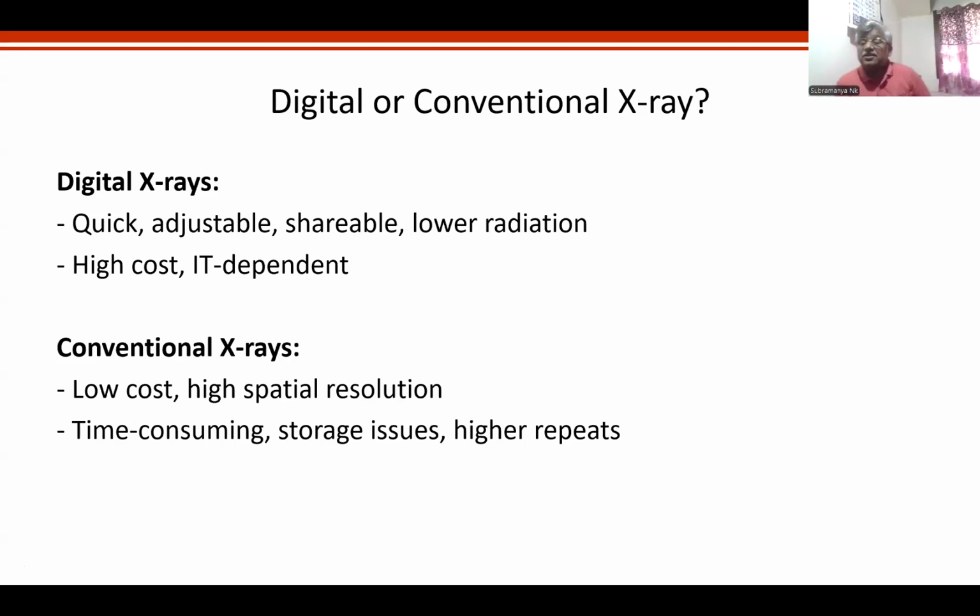And when you take a digital X-ray, ask for them. You ask for adjustability. We never ask. Ask the radiologist to send a film, making it darker or lighter. He will send it to you, and you can actually see.